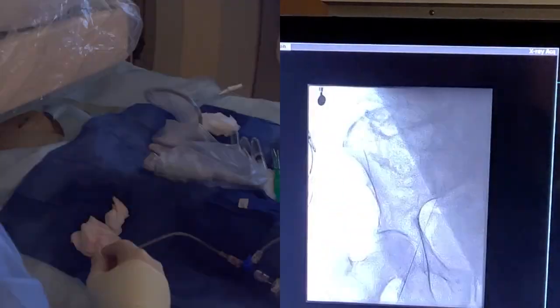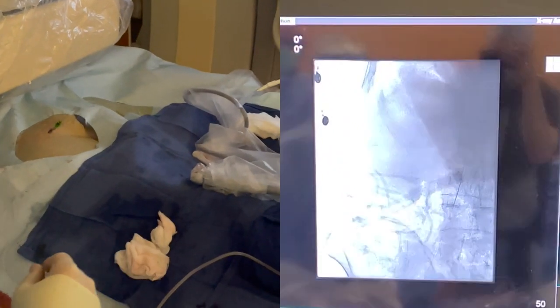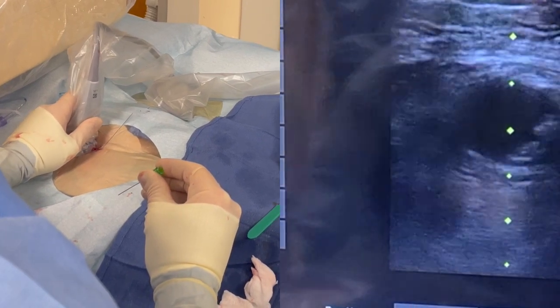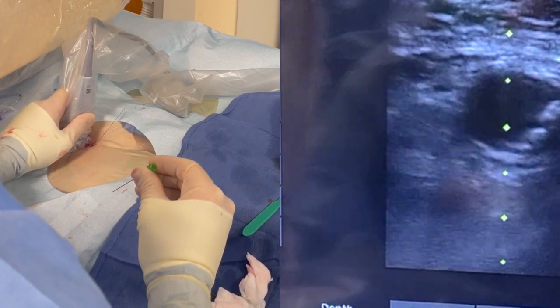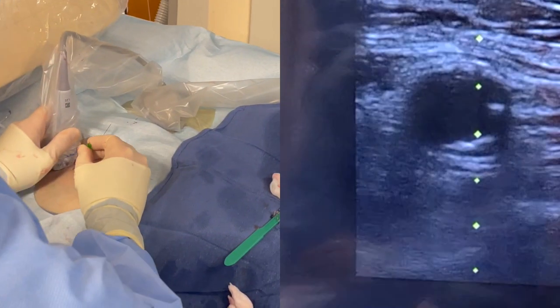And here I'm confirming the tip of the needle is over the femoral head and the wire is in the IVC to the right of the spine. You can see I've left the micro wire in place. This makes it easier to ultrasound the artery while gaining access.